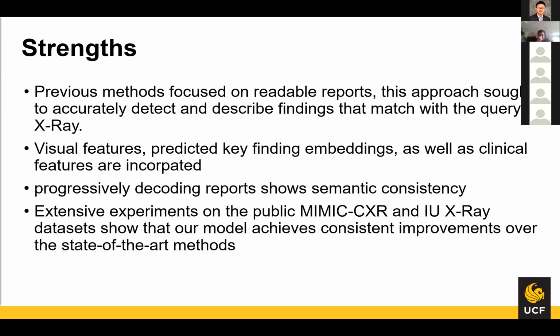So some of the strengths of this method were that previous methods focused on readable reports, while this approach sought to accurately detect and describe findings that matched with the query X-ray. Visual features, predicting key finding embeddings, as well as incorporating those clinical features was definitely interesting and helped them get a better score.